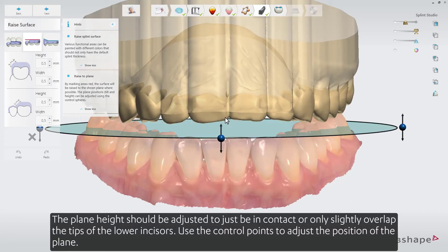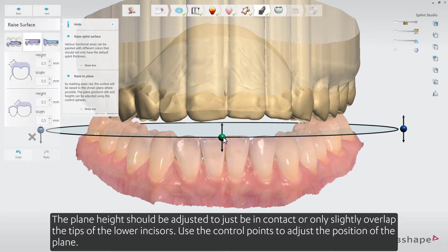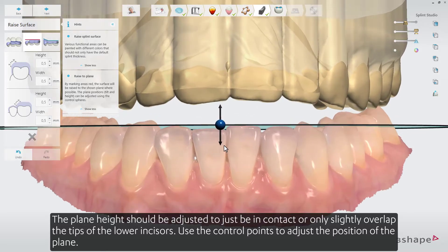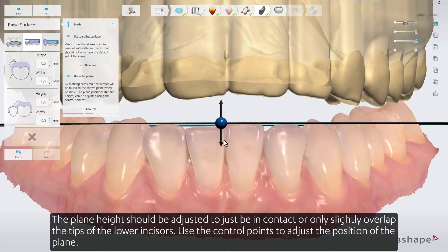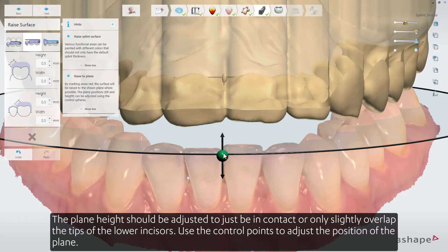The plane height should be adjusted to just be in contact or only slightly overlap the tips of the lower incisors. Use the control points to adjust the position of the plane.